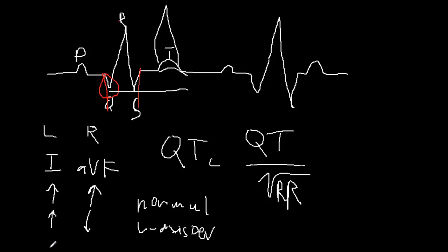And now if the opposite is true, and it's down in lead 1 and up in aVF, well then my right hand is facing up. I have a thumbs up in my right, so that's right axis deviation. And then the last case is if they're both down, and that is called extreme right axis deviation. What that means is there's something real, it's kind of like what they call cardiac no man's land. So you could say extreme right axis deviation. Okay.